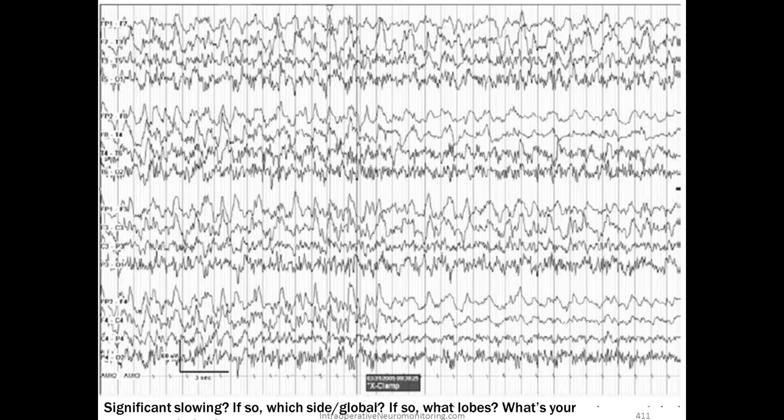Okay, same thing. We go through all the steps. We'll fast forward a little bit more instead of going over it all again, but this does have significant slowing. If so, which side? Is it global? If so, which lobes? And what's your recommendation? So go ahead and pause the video, look it over, make your judgment call. Okay, we're back.